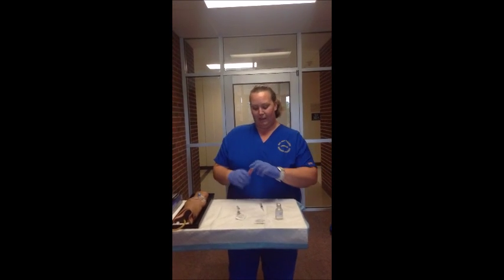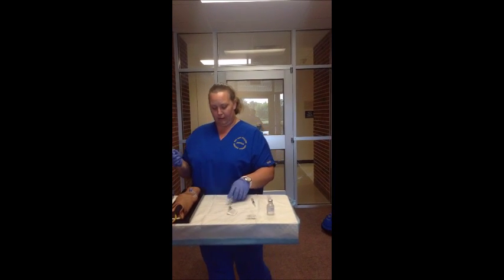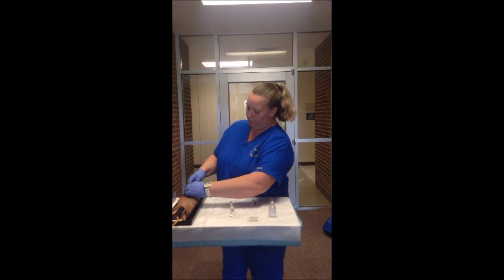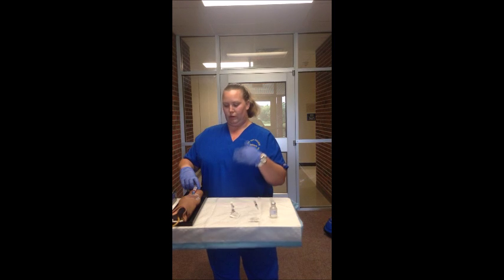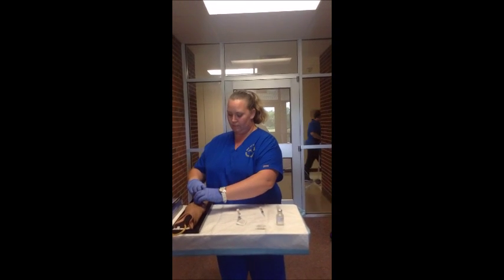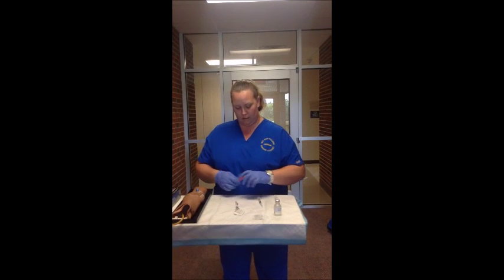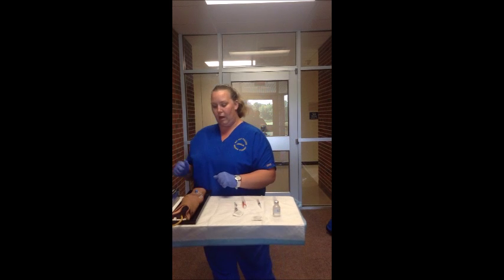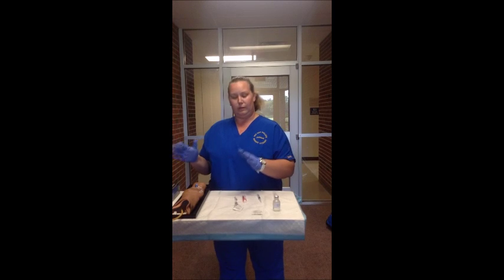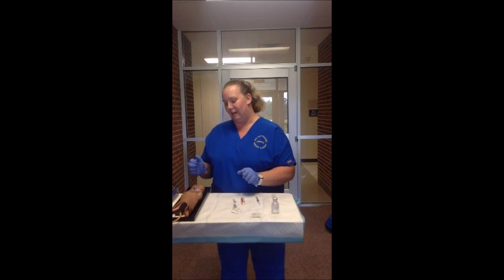Okay. And then I will infuse the next saline, the final saline flush, at the same rate as I did the morphine, to make sure that we don't have any issues or weird tastes in the mouth. During this time, I also would like to note that I would look at the IV site to make sure that it's free of redness and pain or swelling, and I forgot to mention that.